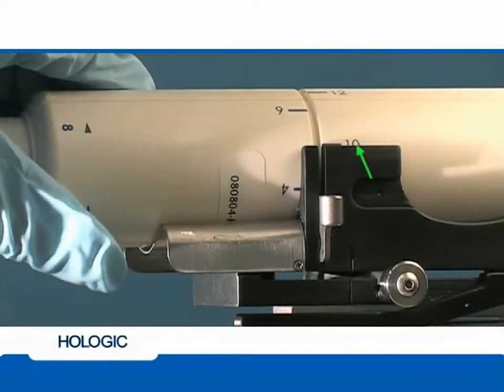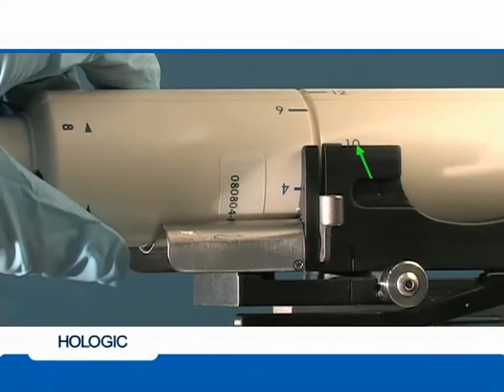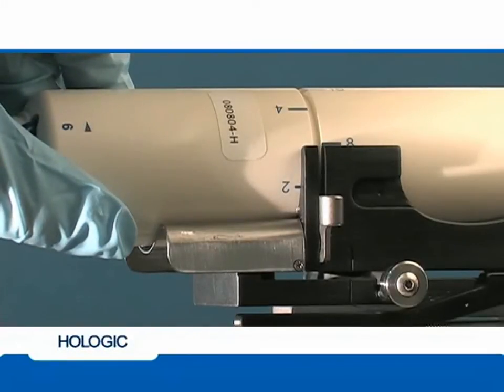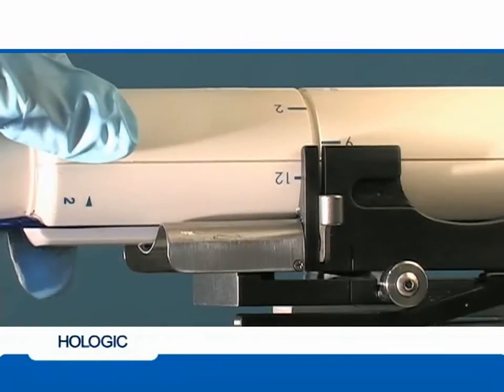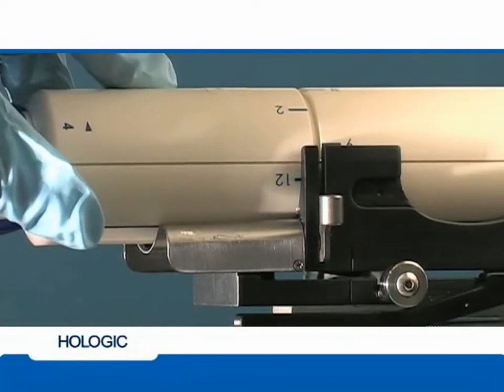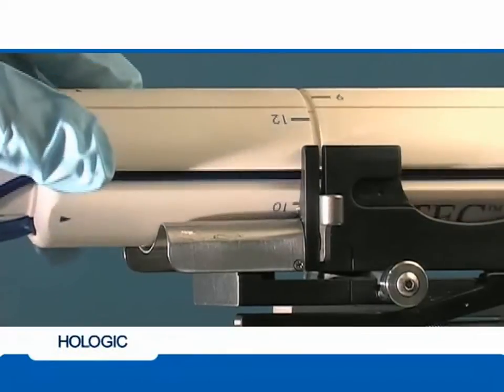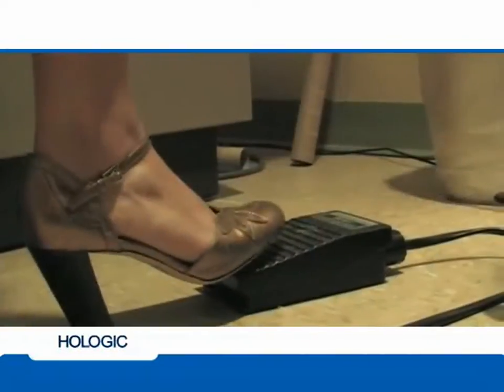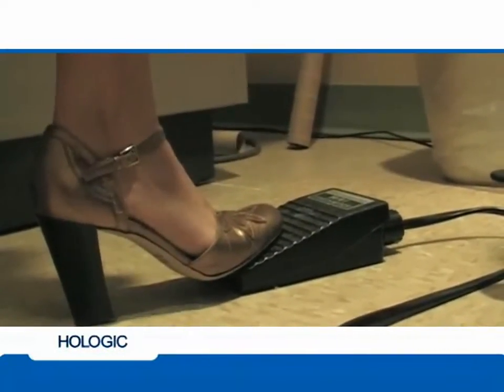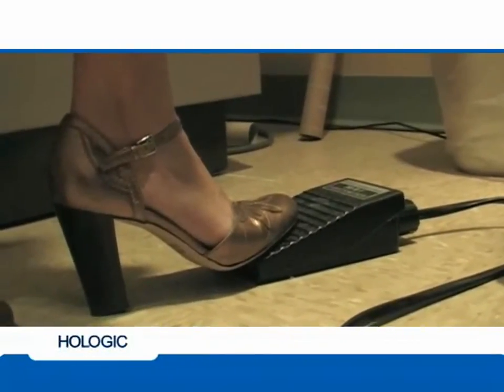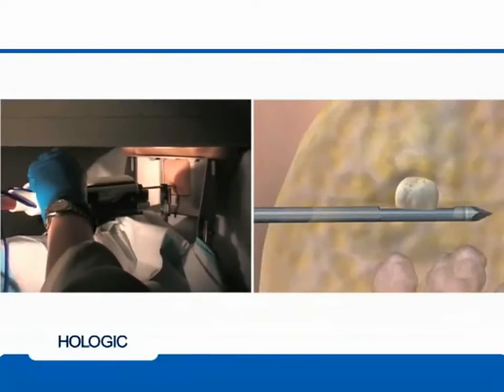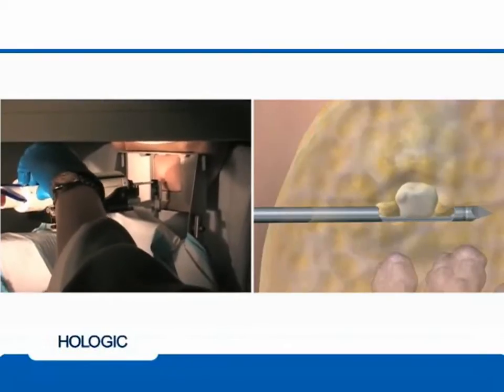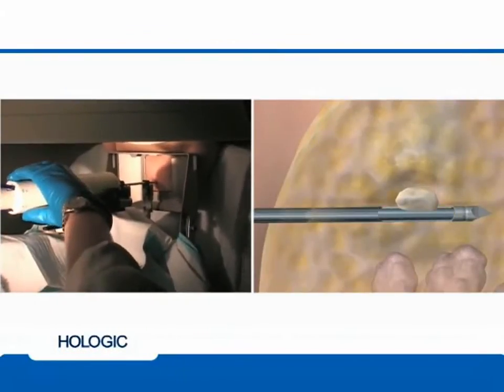The position of the aperture opening, or clock position, is indicated by numbers located on the middle section of the handpiece. Typically, 6 to 8 core samples are adequate for pathology purposes. An audible beep indicates you are at the end of a cutting cycle and it is safe to turn the handpiece to the next clock position. The physician places their hand near the back of the handpiece and depresses the foot pedal to activate the biopsy system, continuing to depress the foot pedal throughout the tissue acquisition sequence. Tissue acquisition occurs every 4.5 seconds. The manual rotation of the handpiece occurs during the resting phase of the 4.5 second cycle, just after the audible beep.